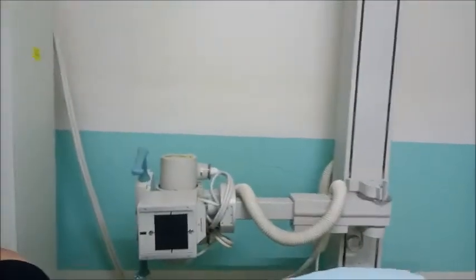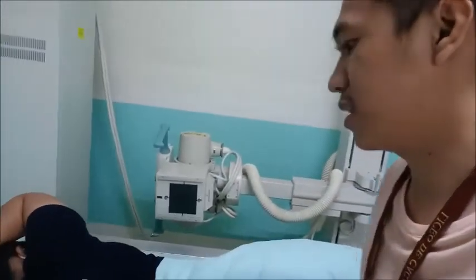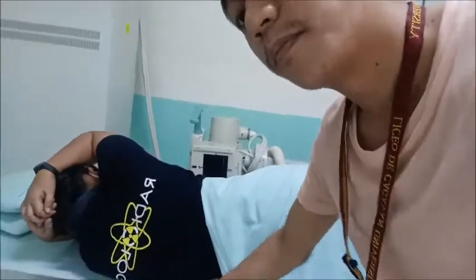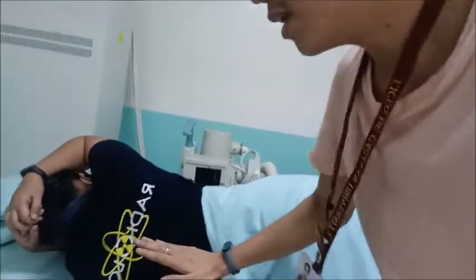So if we expose the patient now, most of the X-rays will be absorbed by the table, and the side of the patient closest to the IR is the affected side. It is closest to the table, so it will not clearly demonstrate. That's why there should be a foam wedge there.